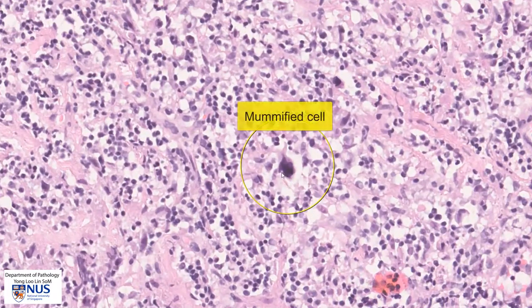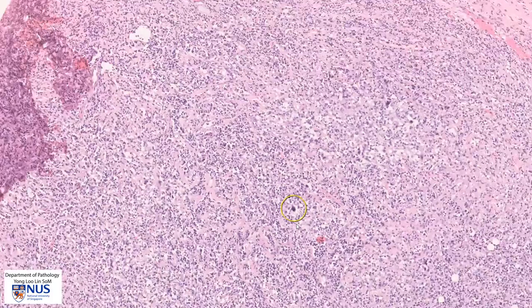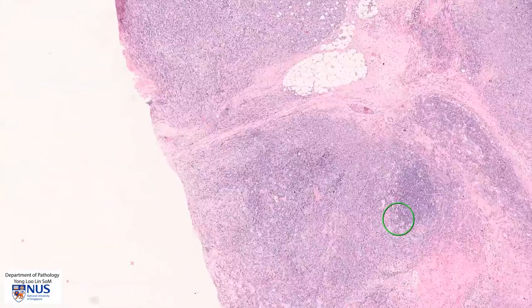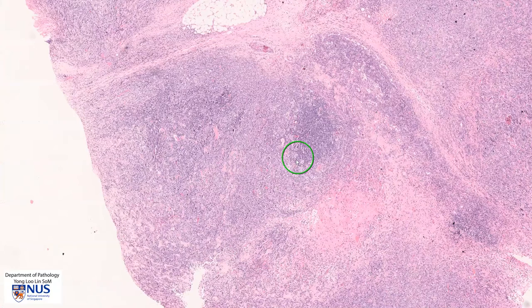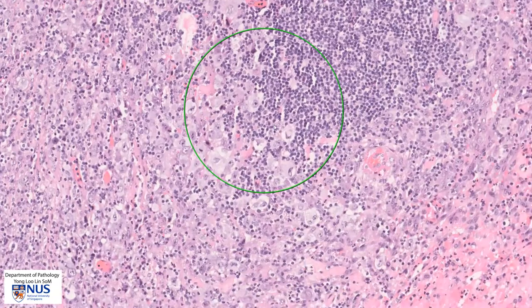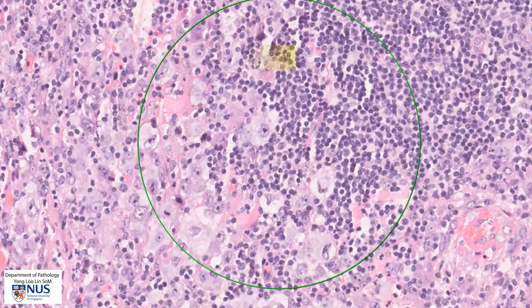Here is a mummified cell with a very degenerate, smudgy appearing nucleus and the whole cell appears somewhat shrunken. Over here, even at this magnification, we can see that there are some pale areas. Zooming in, this is an example of a lacuna cell where you can see the large Reed-Sternberg cell sitting within an empty space.